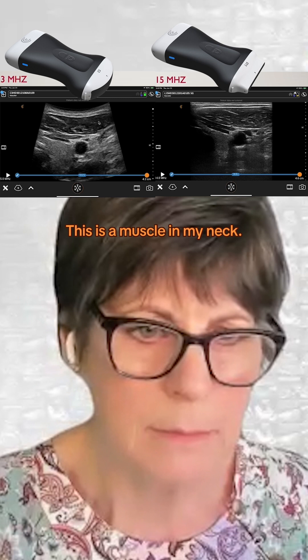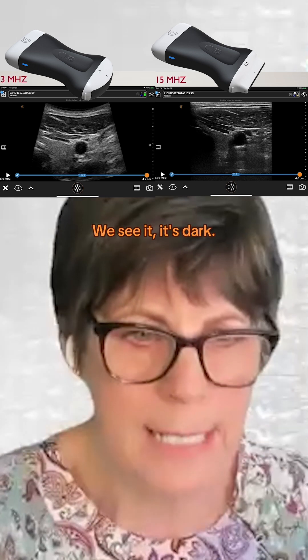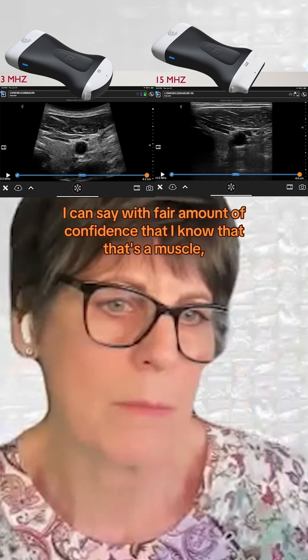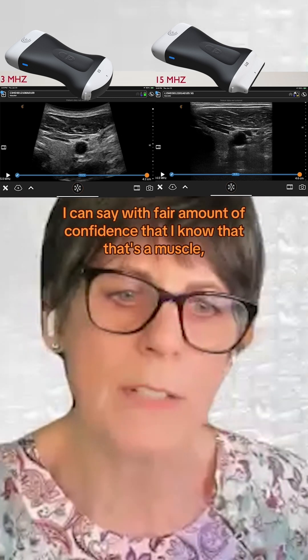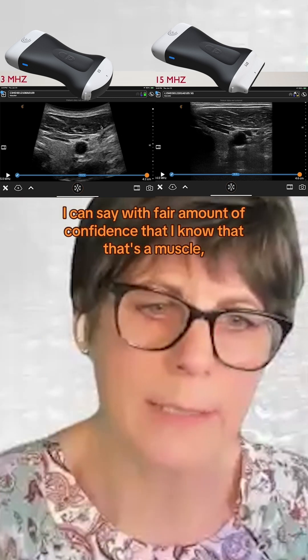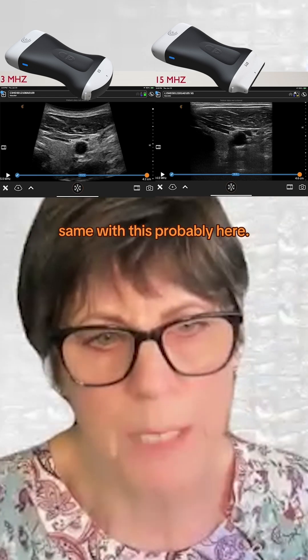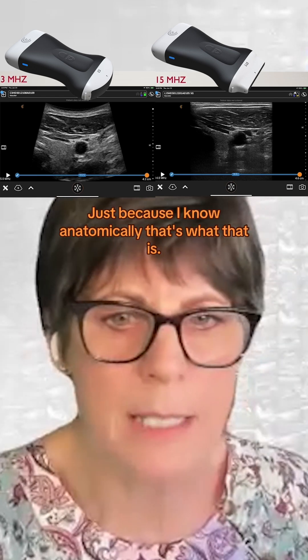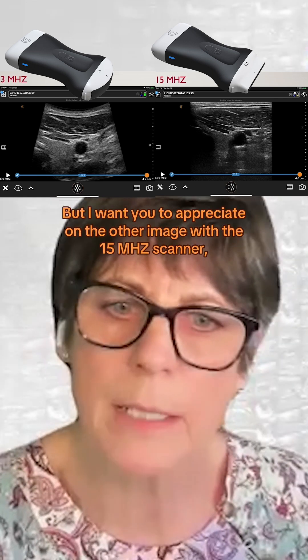This is a muscle in my neck. We can see it — it's dark. I can say with a fair amount of confidence that I know that's a muscle, same with this area here, just because I know anatomically that's what that is. But the structures don't have a lot of detail in them.